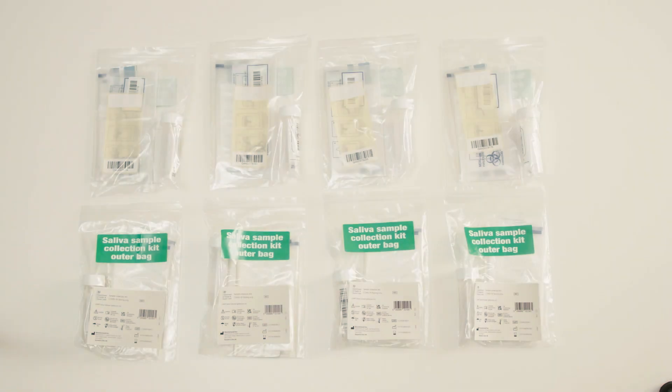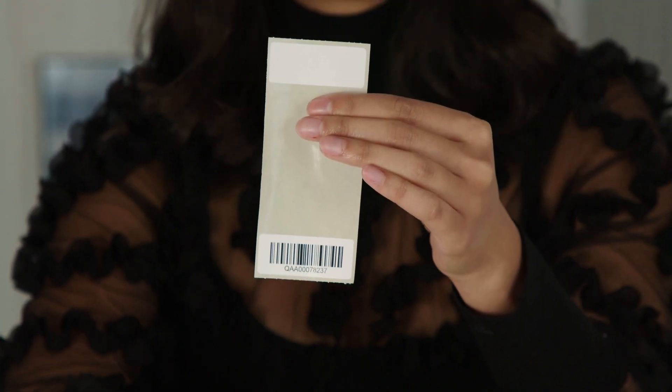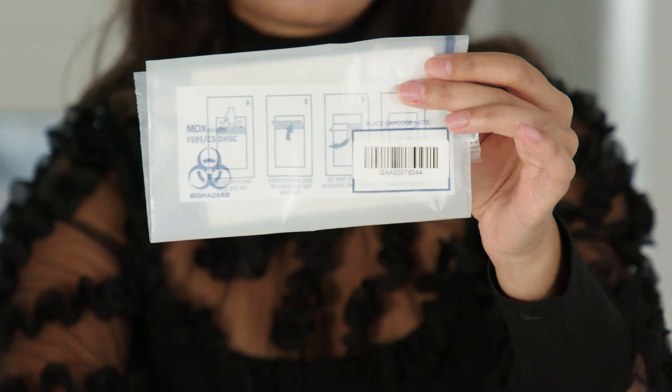You should keep this kit out of the reach of children, as the kit contains small parts that may present a choking hazard. You will be given enough kits for eight tests. Your test kit comprises of a plastic tube with lid, a spare test kit barcode, a leak-proof bag with absorbent pad, and a polygrip bag. Do not touch or remove the absorbent pad from the leak-proof bag.